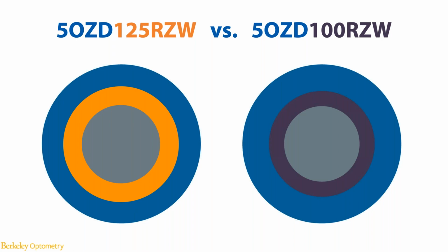Our general goal is to really understand the performance of CRT lens in a smaller optic zone diameter. But the next immediate logical question to ask is, for that 1mm smaller in the optic zone area, where does that extra 1mm go? Do we want to have it all contributing to the landing area, or do we want the return zone width and the landing zone area pretty much to share this extra 0.5 millimeter on each side?